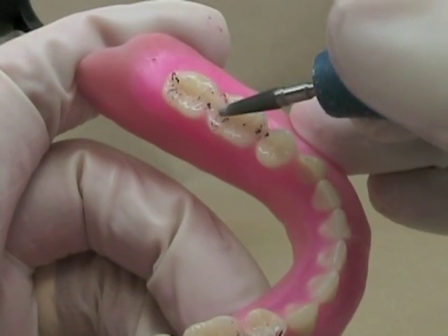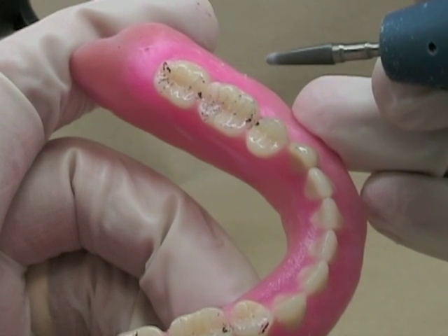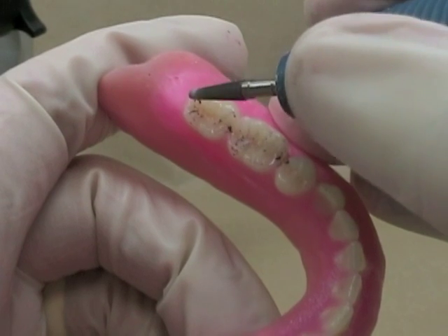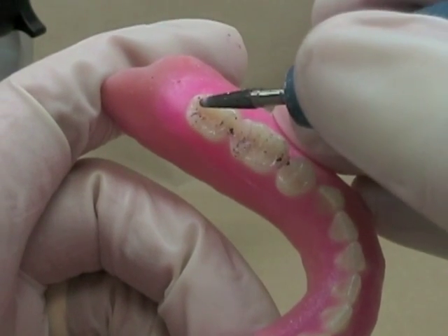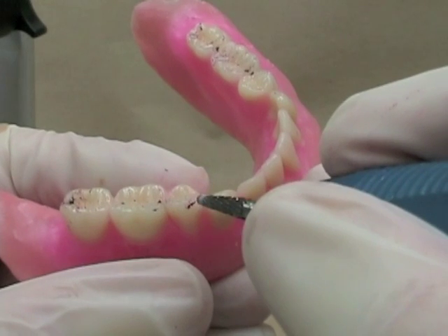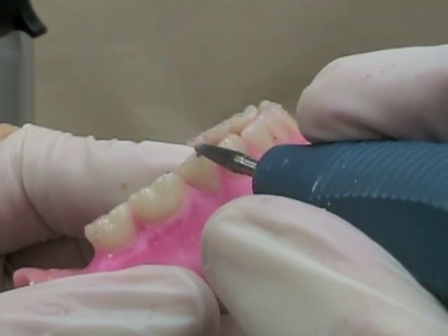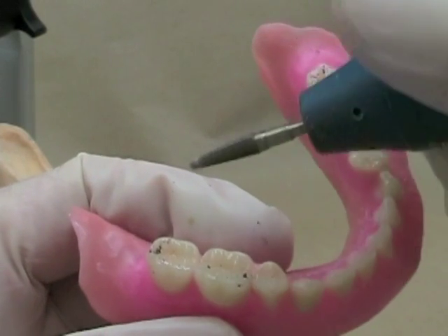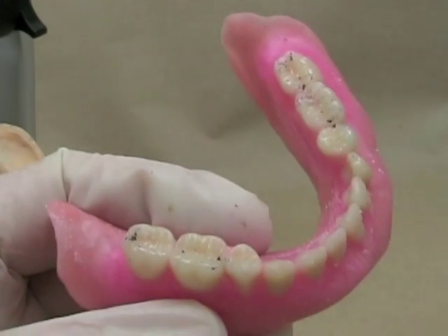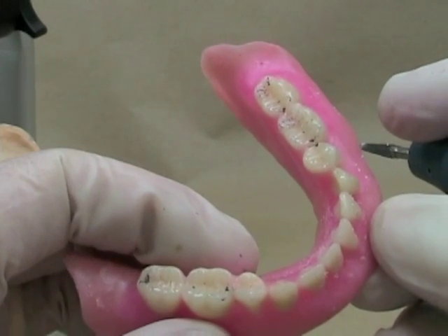This balancing contact is the only one on this side. We're going to remove that so that we can establish other balancing contacts. We might have a little one over here — it's not a line yet, it's a dot. Remember, we want lines, not dots. Let's get rid of that one. Try and maintain your centric stops. On the opposite side, you can see something we really don't want — contact on this buccal cusp. We should not have contacts in that area, so we're going to remove that mandibular buccal contact. Looking at our working contacts, we only have one over here, so we're going to remove that so we can pick up contacts on the other teeth. At this point, we have no mandibular anterior tooth contact at all — that should change as we adjust these contacts.